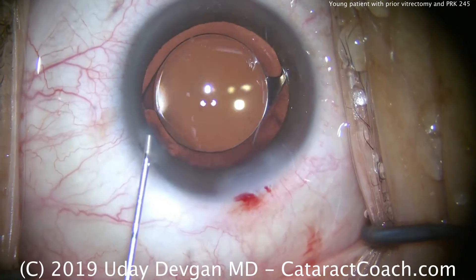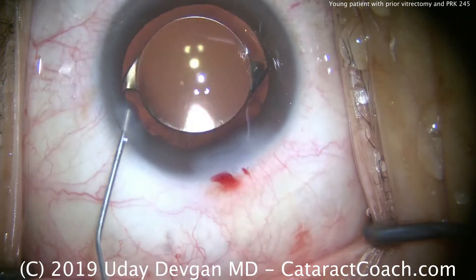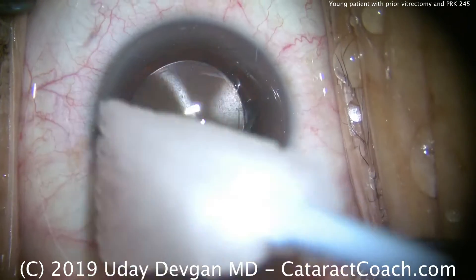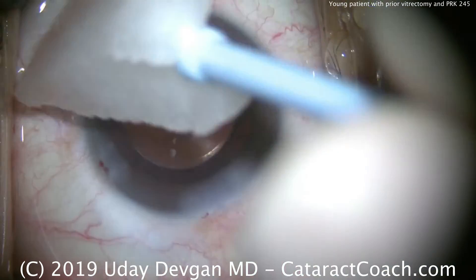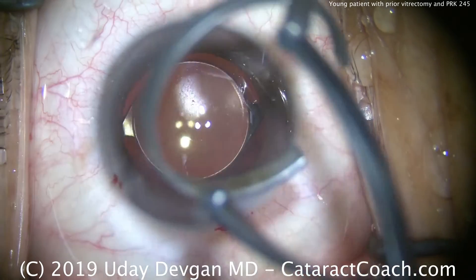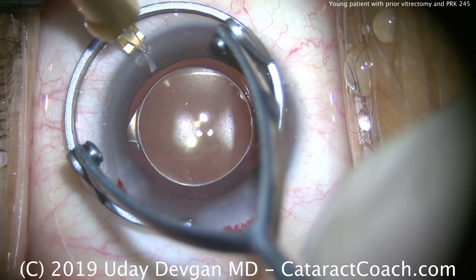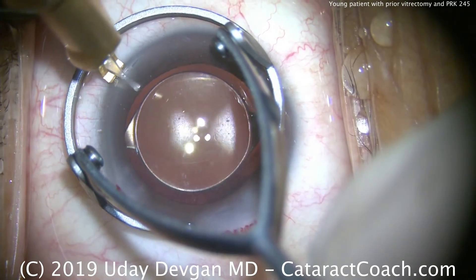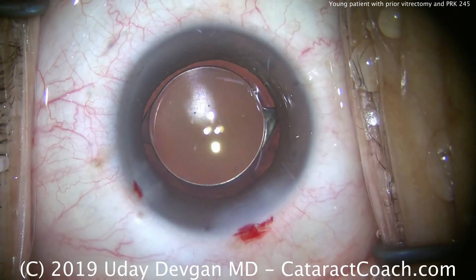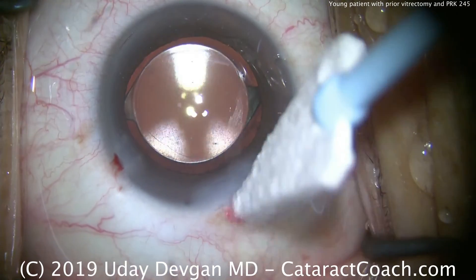We'll also put in a miotic agent, and then some preservative-free Moxifloxacin antibiotic. A cellulose sponge soaked in tetracaine helps seal the incision and anesthetize the eye. We're going to make a small limbal relaxing incision at about this degree mark using the diamond — about a one clock-hour treatment. That looks great. This patient is doing beautifully, and of course there are very important teaching lessons in this case.